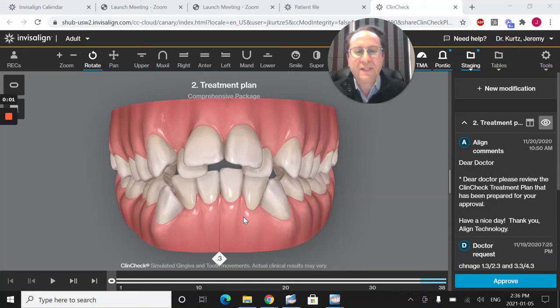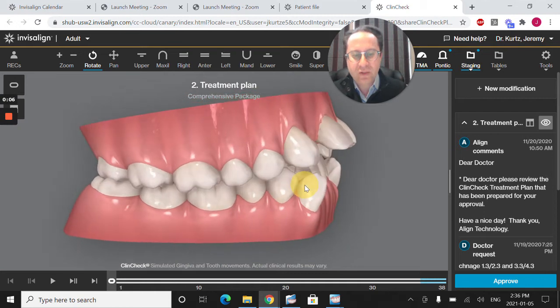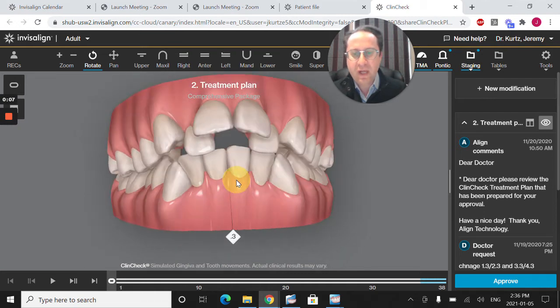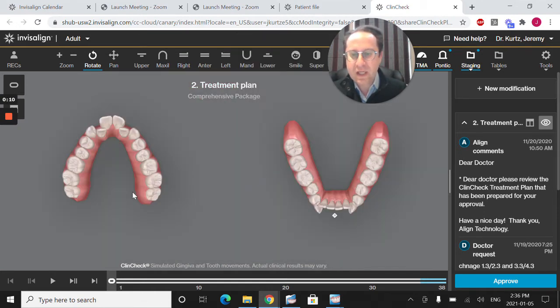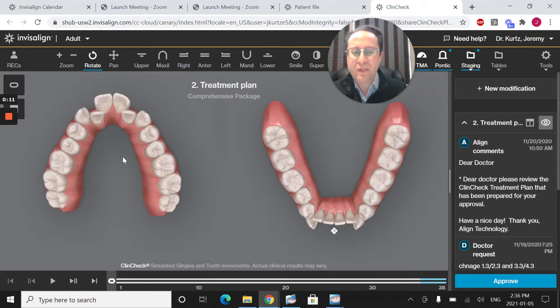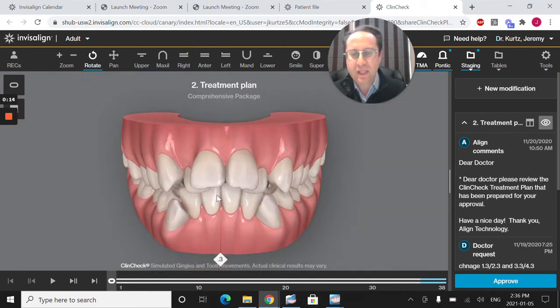Hi everyone, here's an example of what a ClinCheck review video would look like. Now, when you look at this case and you see how crowded everything is, you're going to wonder, is this really an Invisalign case and how am I going to do this?